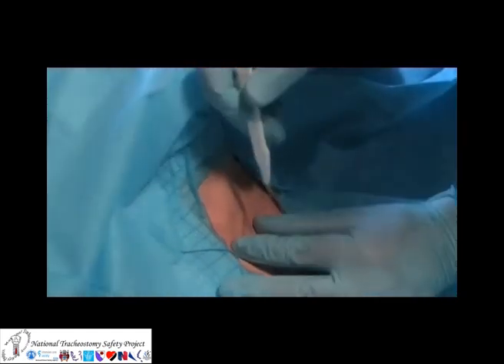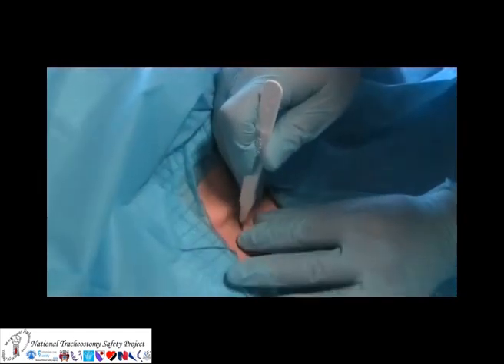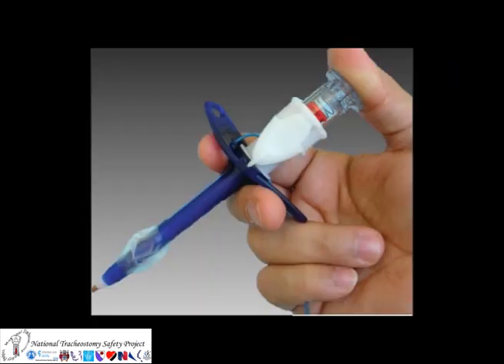Following the identification of the landmarks in the neck, a small incision is made. When pressure is applied to the tip of the PCK needle, the red flag indicator near the top becomes visible. This can help to identify entry into the hollow trachea and also when the needle touches the posterior wall of the trachea.